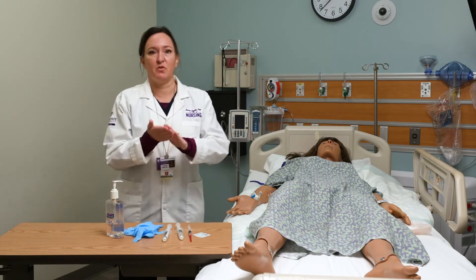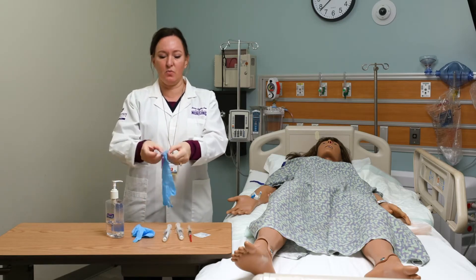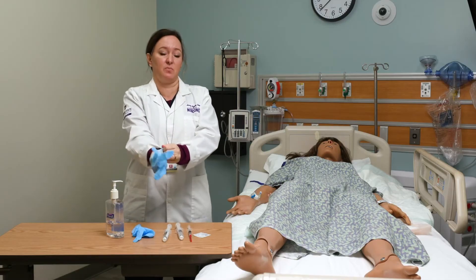That brings us to the point where we're ready to give the medication. If you haven't already performed hand hygiene, do so. It's always a good idea to wear gloves, even though we are not very likely to be exposed to blood or body fluids.